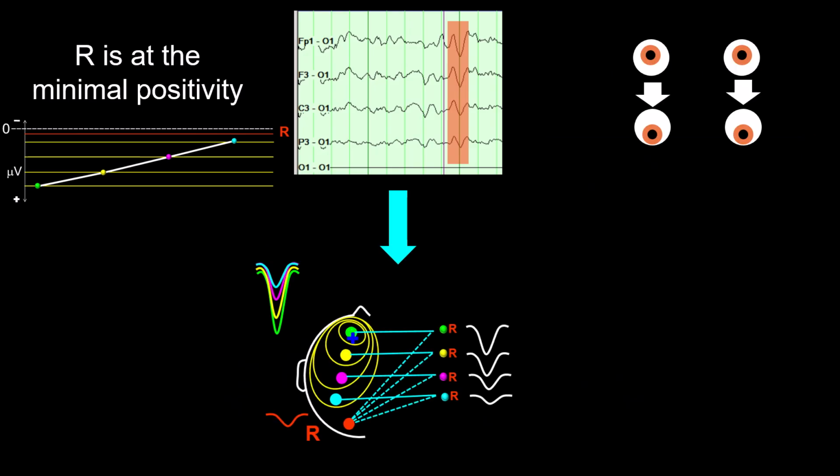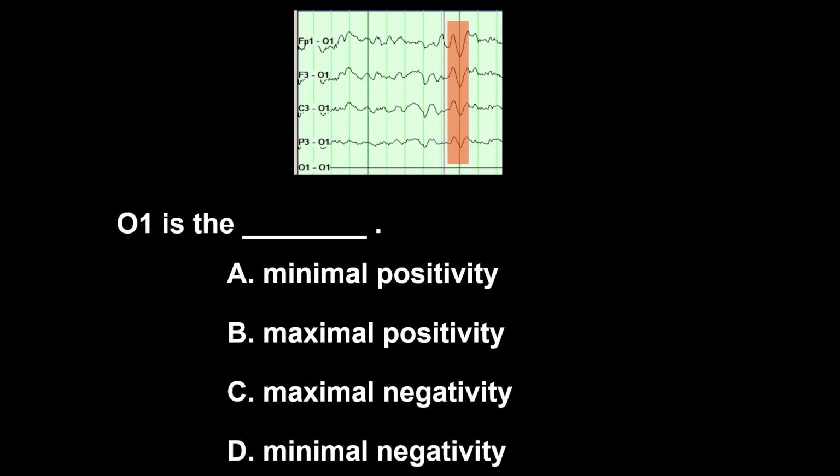The choice in this case is easy, since I think that from the very beginning you recognized this activity for what it is, eye movement. From the point of view of sequential thinking, it is important that we remember all the assumptions to which we have alluded. So the answer to this question is A.